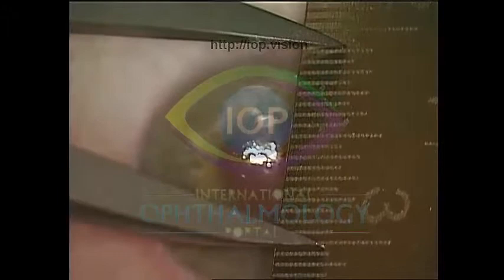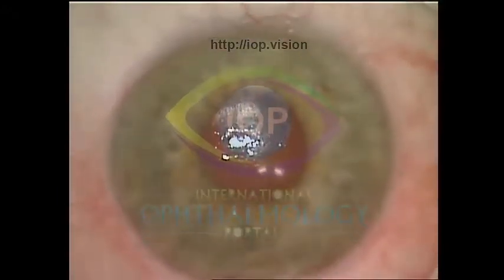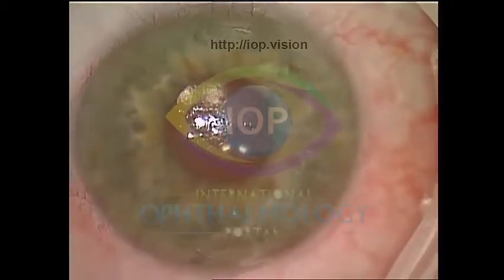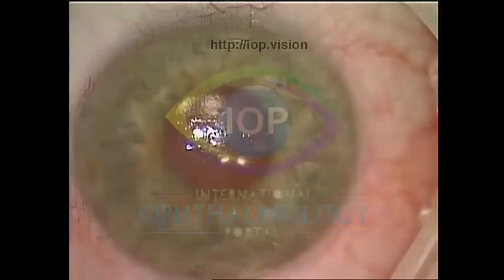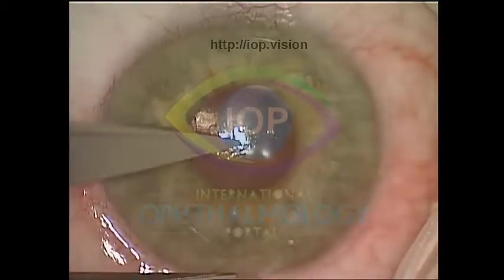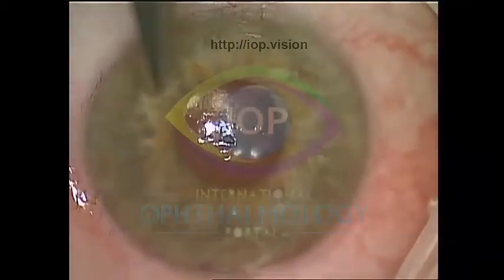And I just wonder, for example, how much astigmatism we cause by making a 4.5 millimeter incision versus a 2.75 cataract wound or what have you. I know it's different. In my own patients, I haven't measured it per se. And again, it goes back to the issue of what's the visual function of the patient? What are their visual needs? What are their refractive expectations?